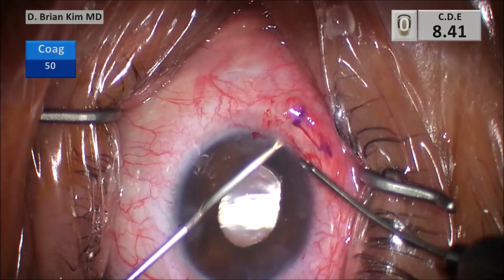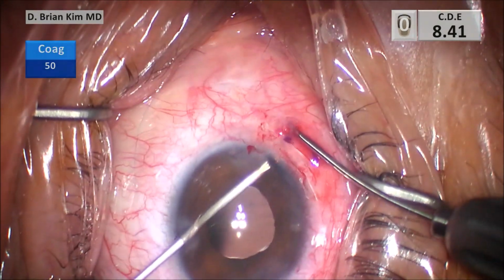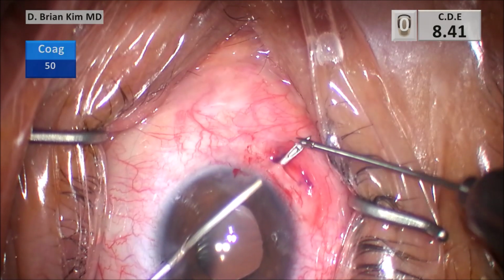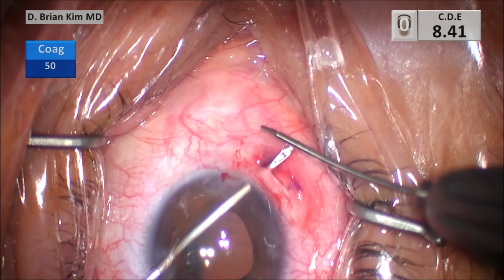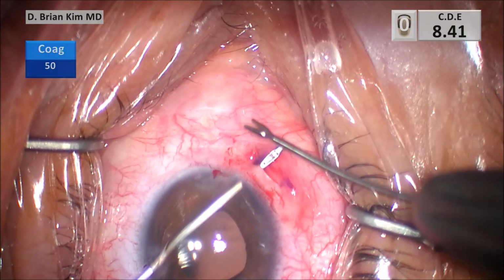So you can see the needle is going to emerge from the groove. Even though this is a blind pass, it's really fairly anterior, so the chance of you causing any peripheral damage to the retina or ciliary body is pretty low because you're, again, fairly anterior. You're just grabbing the peripheral iris root, the area that's disinserted.